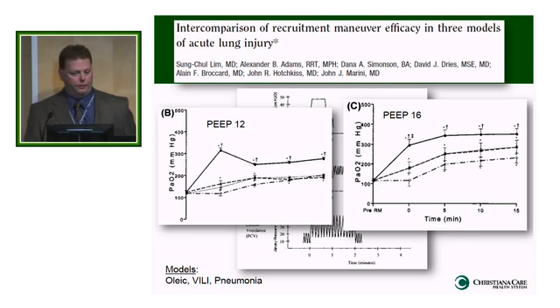So they do that 30 for 30, 40 for 40. Or they do a modification where they're kind of inching up the PEEP and the PIP over time, and then they kind of go back down over. So this is sort of a schematic of that. Or they put the patient on pressure control ventilation with a higher PEEP level at that point. So they use pressure control ventilation as a recruitment strategy for this patient.